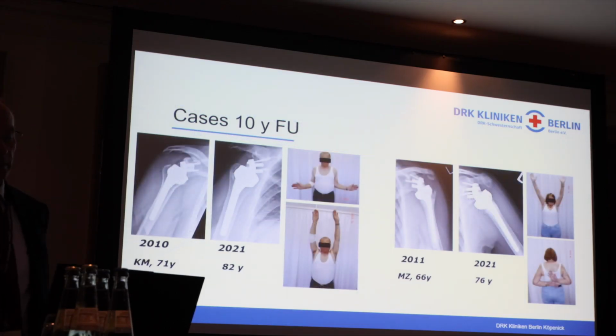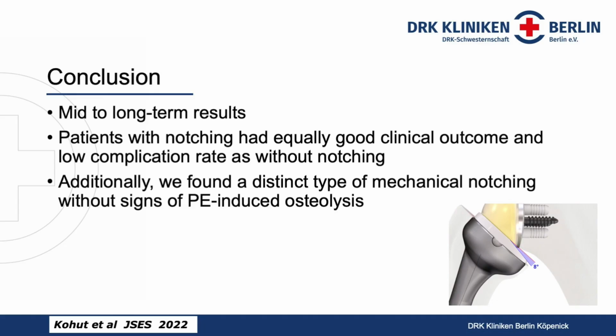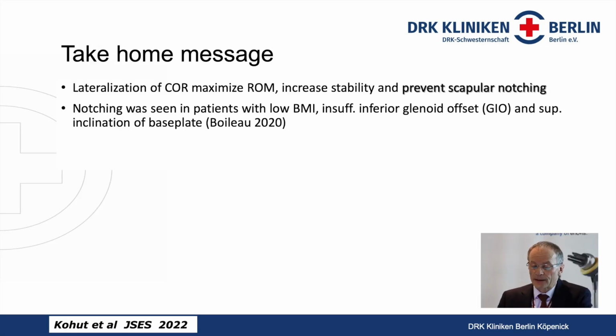This is a case from my hospital. I operated on this patient in 2010 and 2011, and you can see the X-ray and the function after 10 or 11 years. So in conclusion, we have now mid to long-term results, and the patients with notching had equally good clinical outcome and low complication rate as those without notching, but we found a distinct type of mechanical notching without signs of PE-induced osteolysis. Of course, the lateralization of the center of rotation maximized the range of motion, increased the stability, and prevented notching.